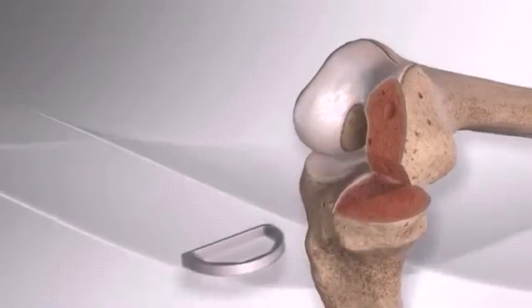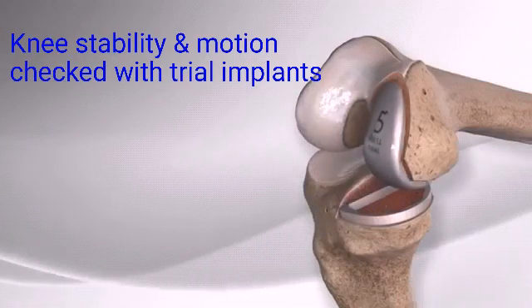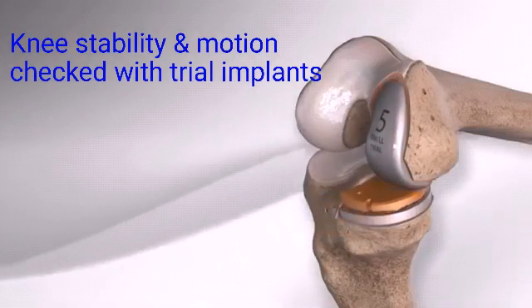Prior to final preparation of the tibia, trial implants are placed into the knee to make certain they are the correct size.